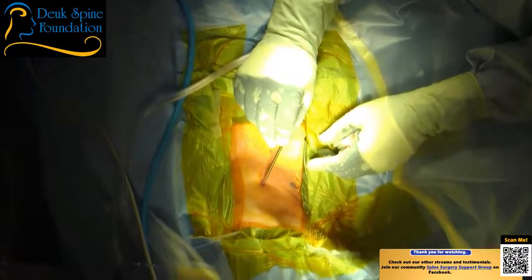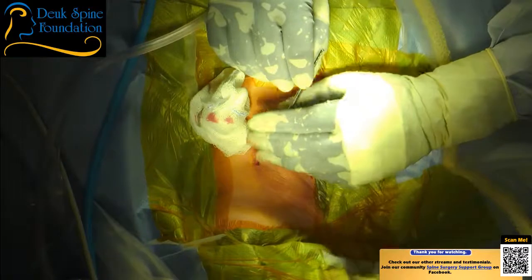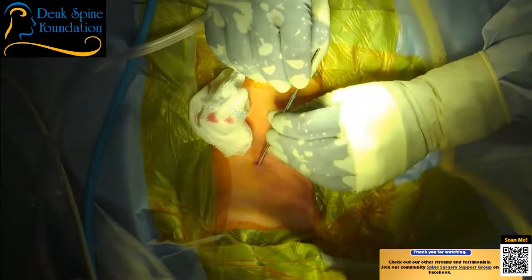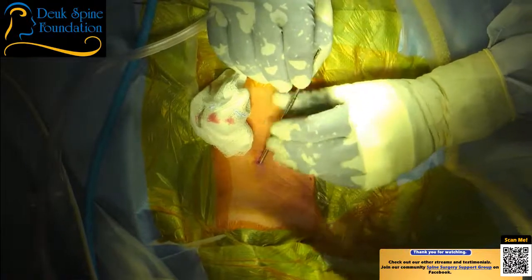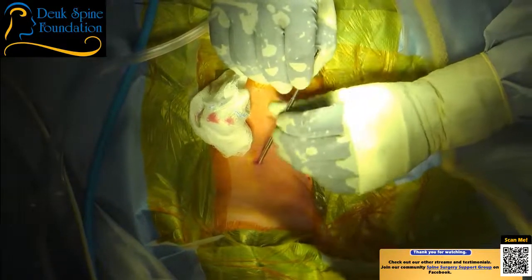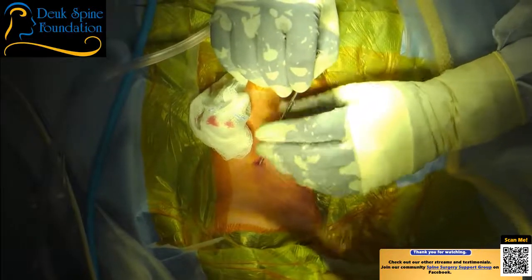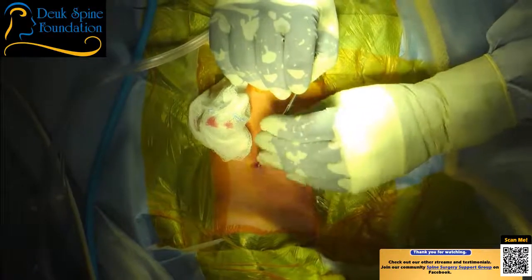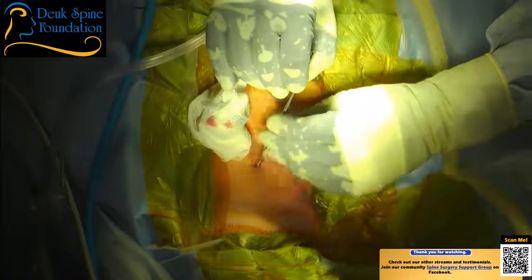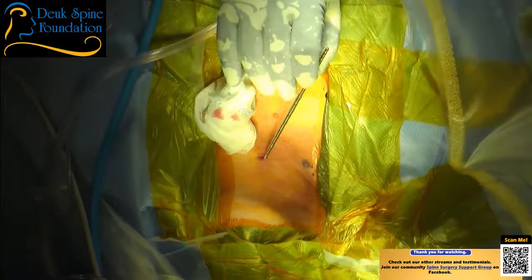Now the tube's diameter is 4 millimeters. That's why the incision has to be 4 millimeters. But can you imagine what an incredible small incision that is? The recovery from this surgery is virtually an hour. And then by the next day, people are back to normal activities, except they can't lift anything heavy and they can't play contact sports yet. So heavy lifting and contact sports should be avoided until the spine is completely healed. So everybody gets a 25-pound lifting restriction. Now you can see right there in the x-ray about halfway down is the front of the tube.